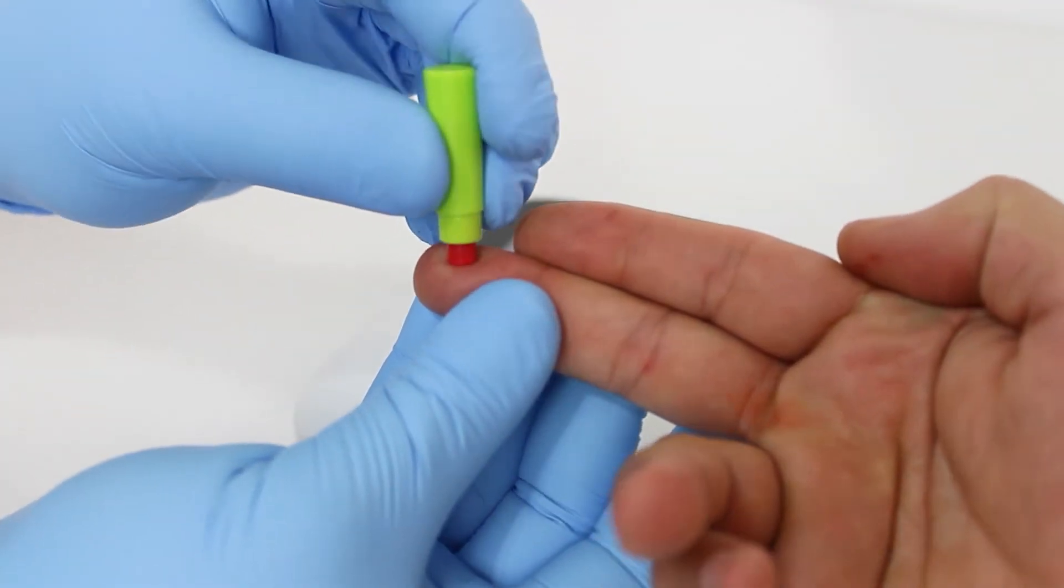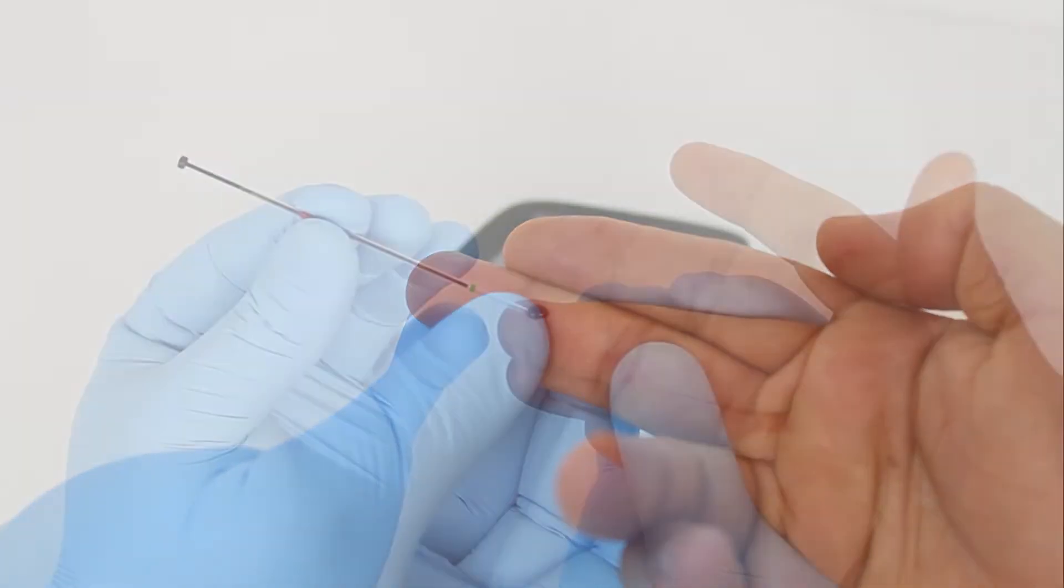Lance the finger and collect the blood sample using the sample transfer tube included in the kit.